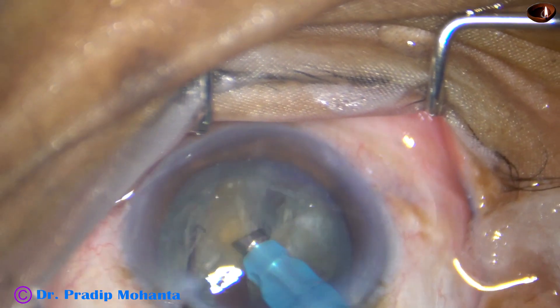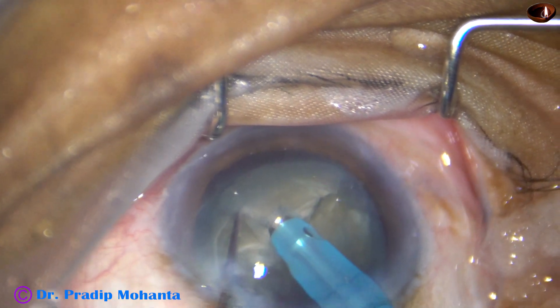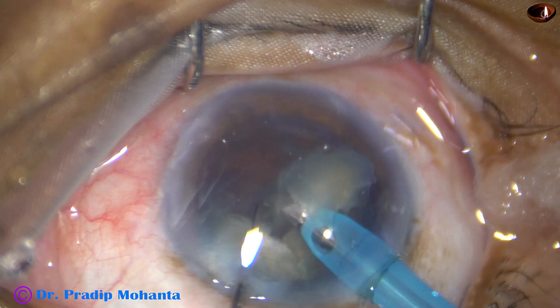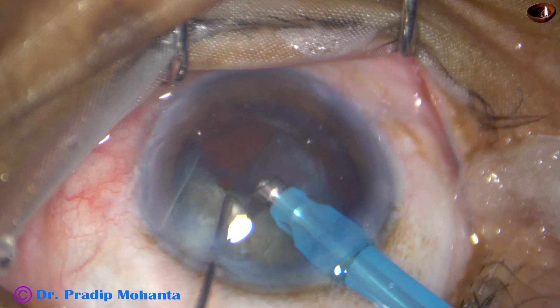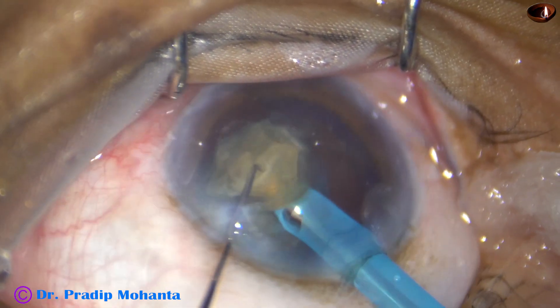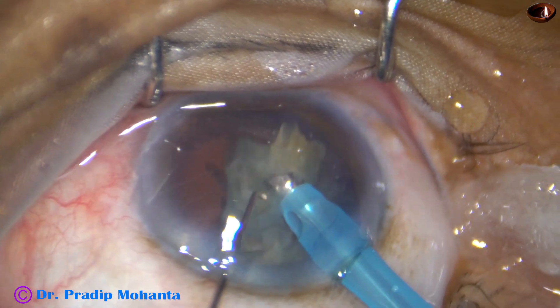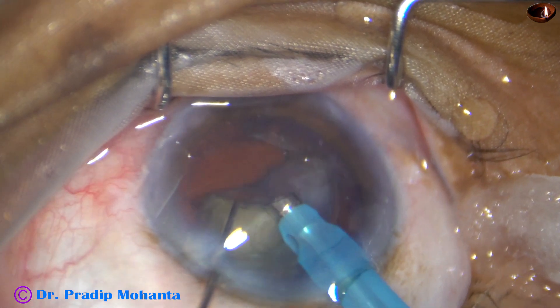And this way this quadrant is removed. Now this is a hemi-nucleus, it is chopped into two parts. And now each part is emulsified and removed. FACO power used in this case is 80%. Flow rate is 45 ml per minute. Vacuum is 450 mm of mercury. This is Faro's from Oatley, Switzerland.